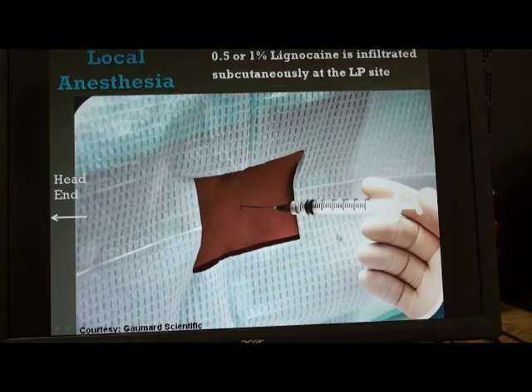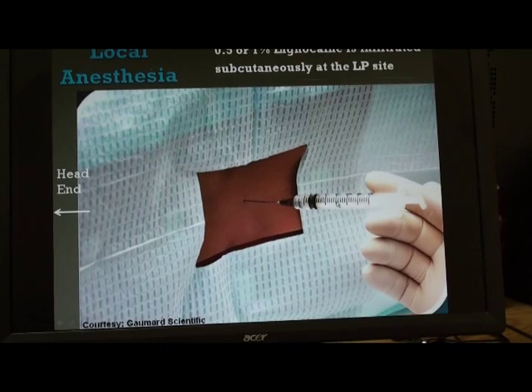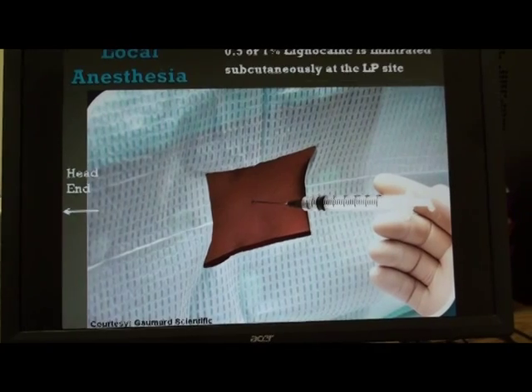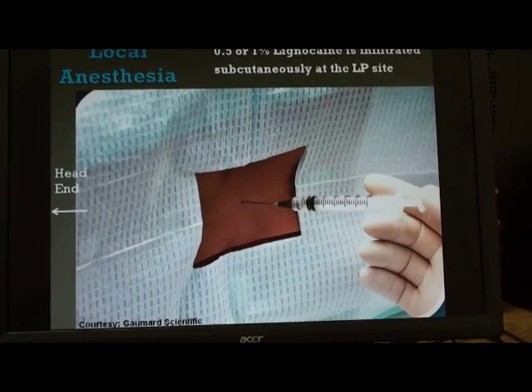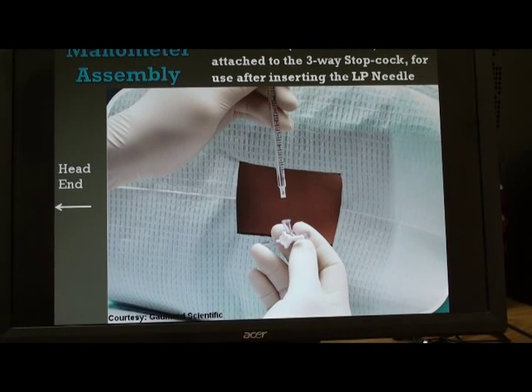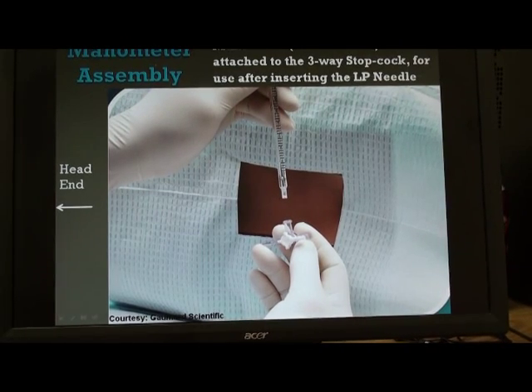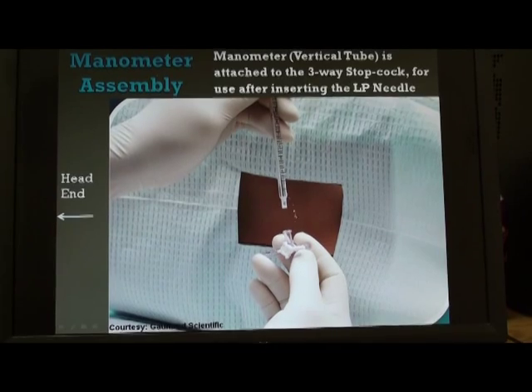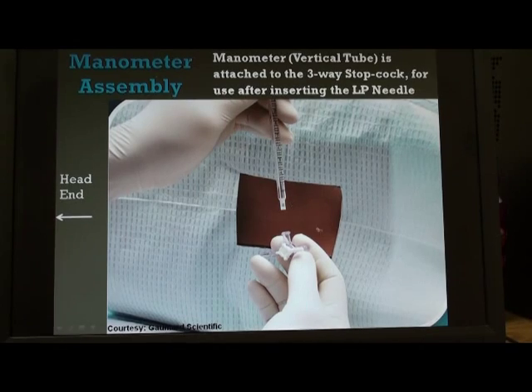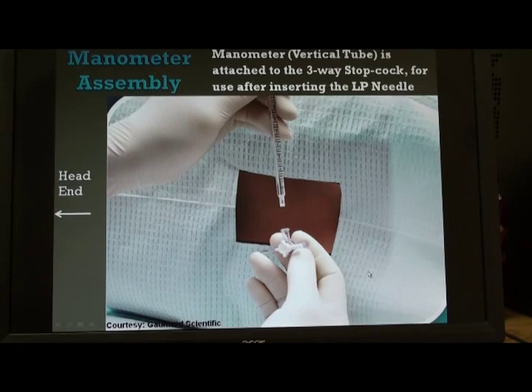The next step is to infiltrate local anesthesia as if we are doing it on a patient. The local anesthetic agent usually used is lignocaine 0.5% or 1%, infiltrated in the subcutaneous plane so that the patient will not feel the pain of the lumbar puncture needle. We then assemble the manometry assembly — the burette, which is the vertical tube used to record lumbar pressure, connected via a three-way stopcock to the lumbar puncture needle, and keep it ready for pressure recording.